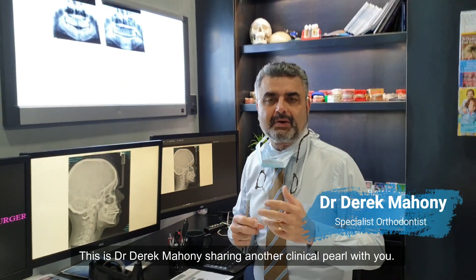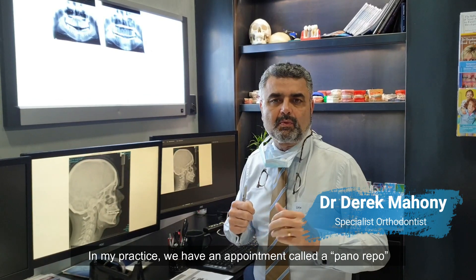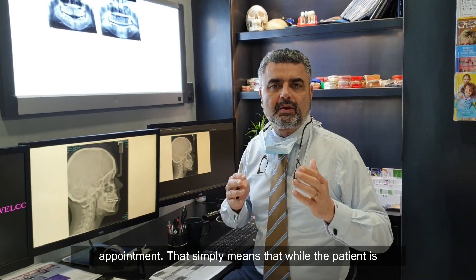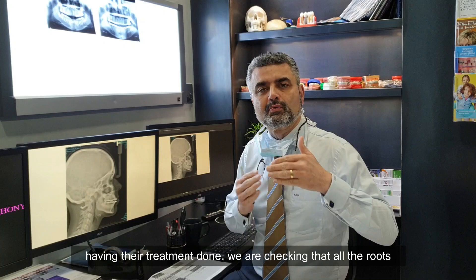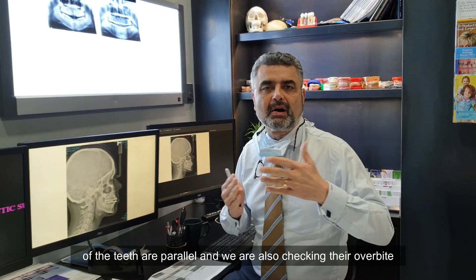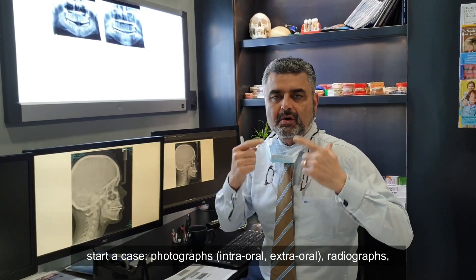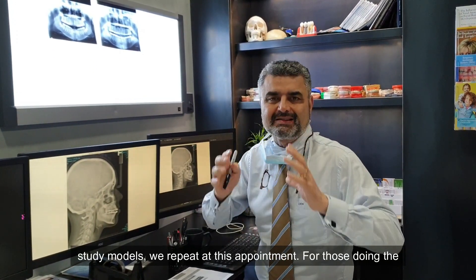This is Dr. Derek Mahoney sharing another clinical pearl with you. In my practice, we have an appointment called a Pano-Repo appointment. That simply means that while the patient is having their treatment done, we are checking that all the roots of the teeth are parallel, and we're also checking their overbite/overjet relationship. So all the records I take before I start a case — photographs, intraoral, extraoral, radiographs, study models — we repeat at this appointment.